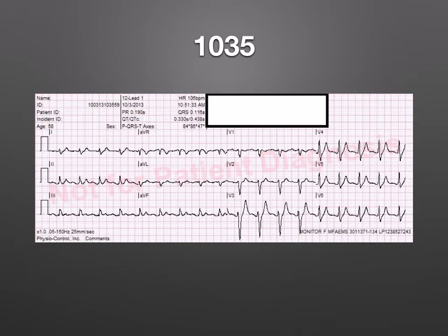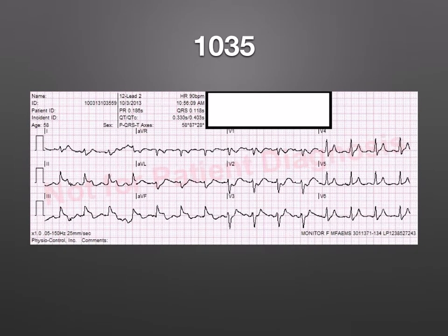Now the next ECG is substantially different. So as we take a look at that, not only did our T waves change, we now have ST segment elevation in the inferior leads, along with some depression in the lateral leads in AVL. This now meets our STEMI criteria. We clearly have the ECG criteria, and a post-ROSC patient is an appropriate clinical setting.